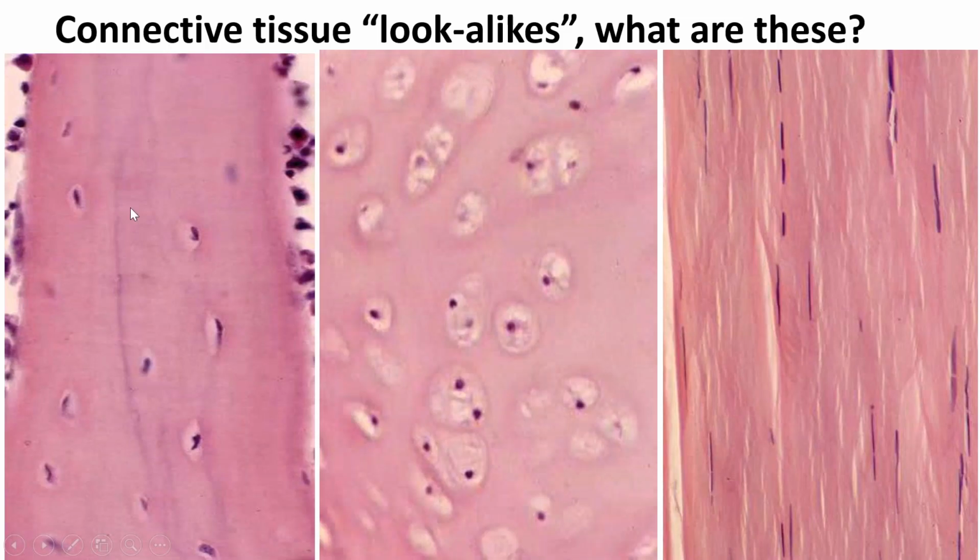So now I have 3 slides in here to see what we've learned, okay? I want to start in the middle, and I put this one in. This is a bad slide. You look at it, it's bad because of poor preparation. This tissue is not well fixed. This is hyaline cartilage. And if you look at this, you have no indication that there's any kind of proteoglycans here. This is basically all eosinophilic. And this is what a lot of our slides have a tendency to look like over time, and you go, how can this be hyaline cartilage? But this is why I picked it.